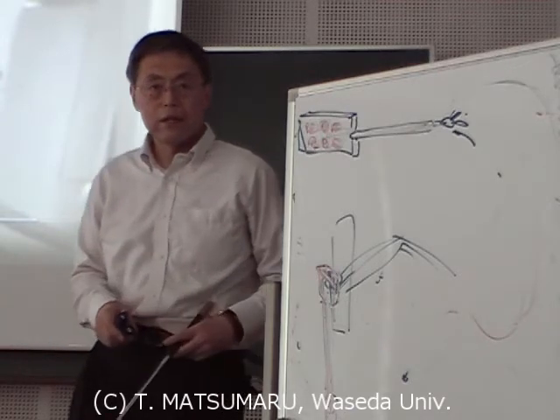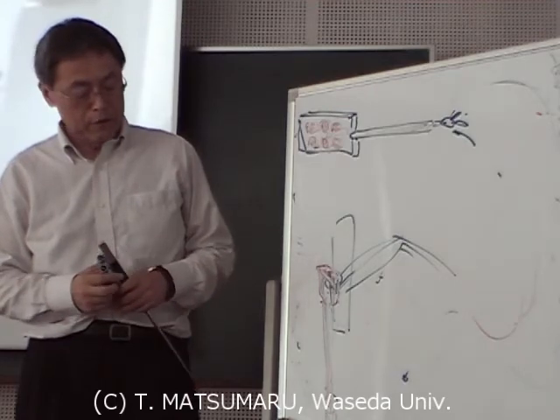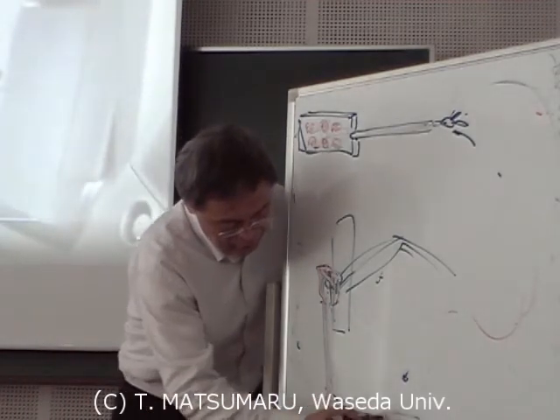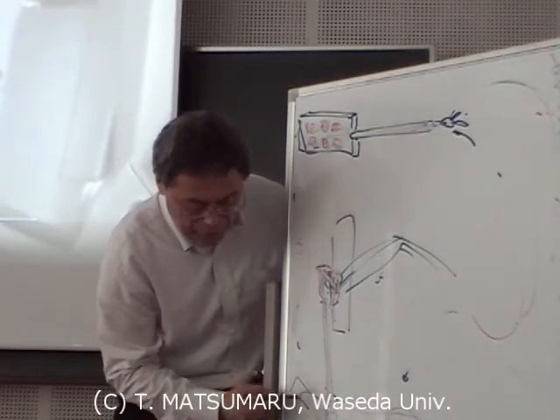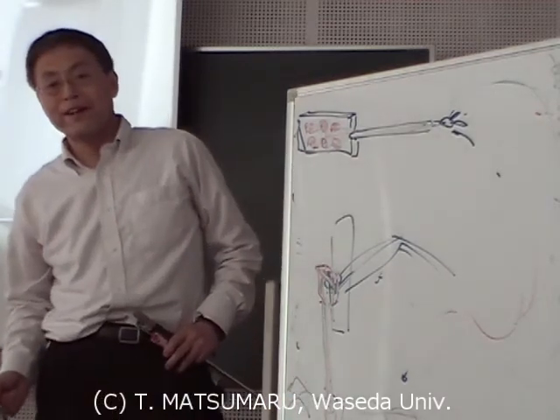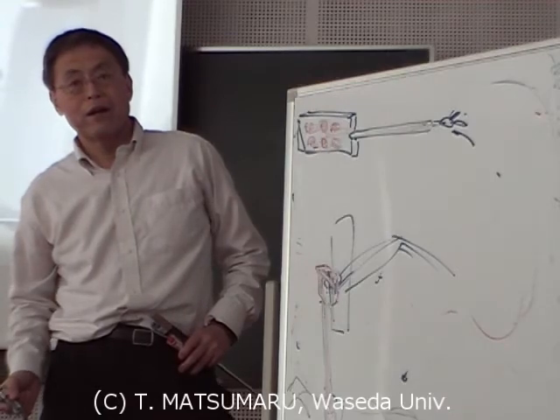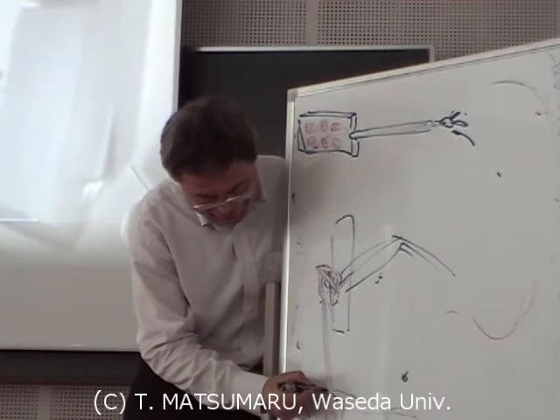Why is this system necessary? They can cause less pain to the patients. This part is inserted into the patient, so they only need a small hole.